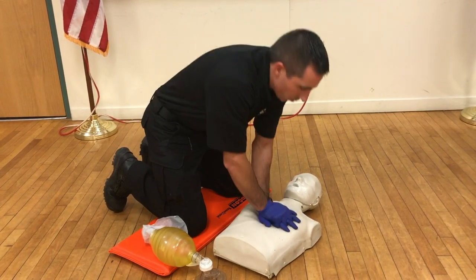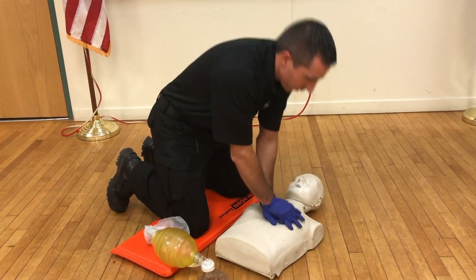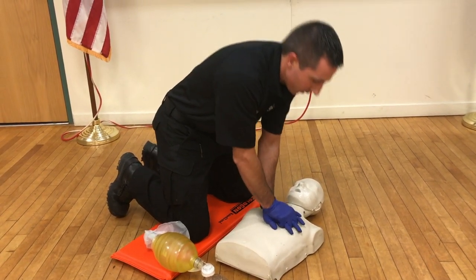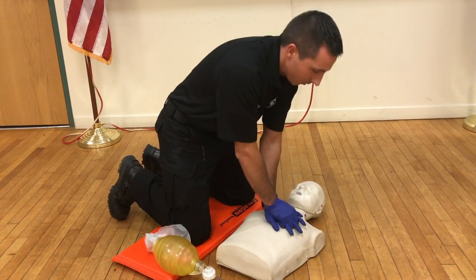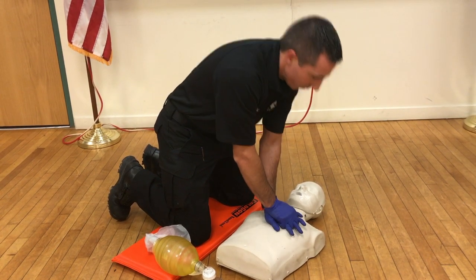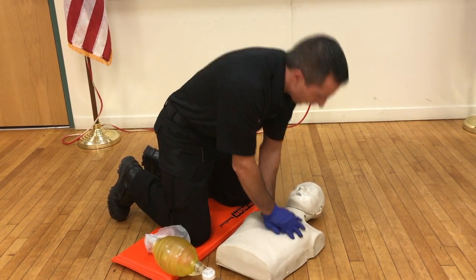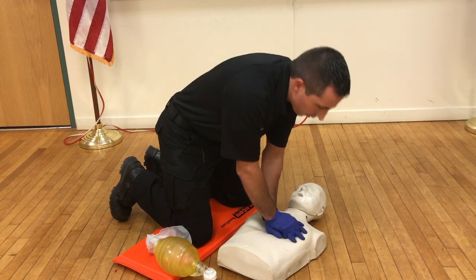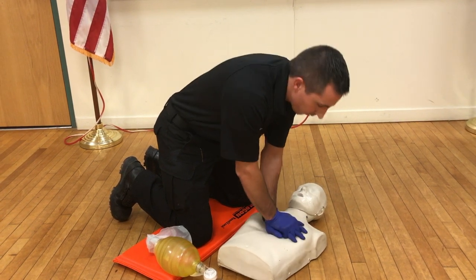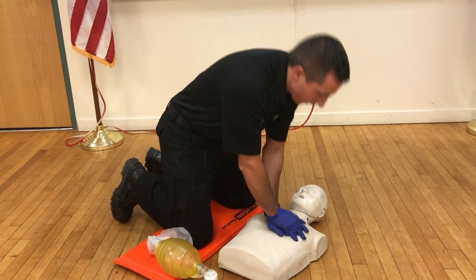Fourth and fifth cycles of compressions: 1, 2, 3, 5, 6, 28, 30. Then 1, 2, 3, 5, 7, 28, 30. Continuing CPR cycles with two breaths after each set of 30 compressions.